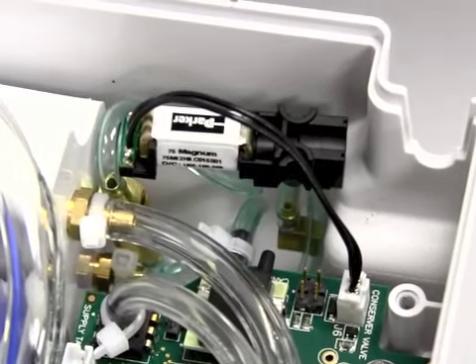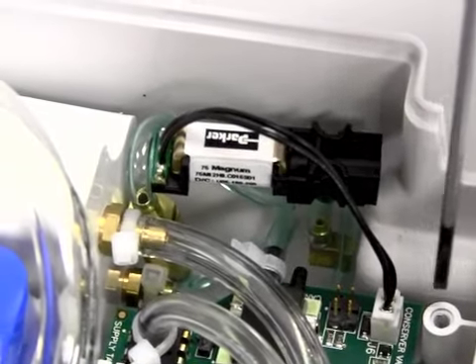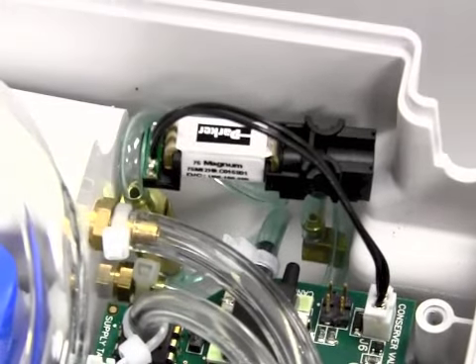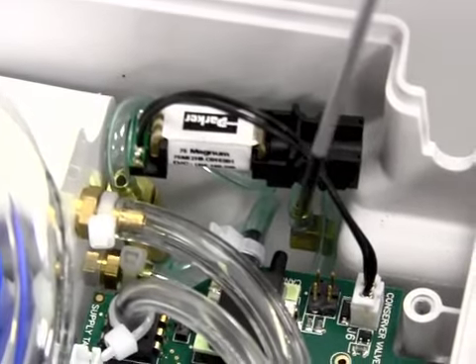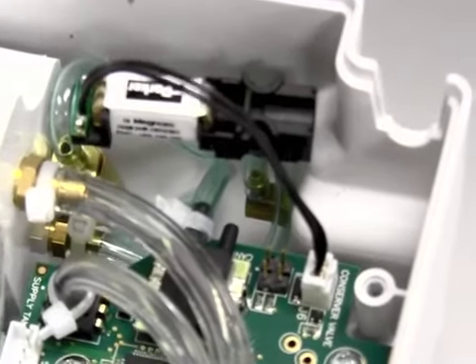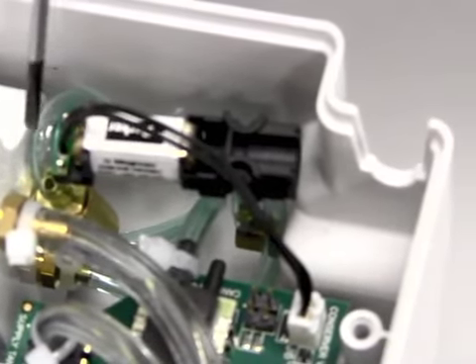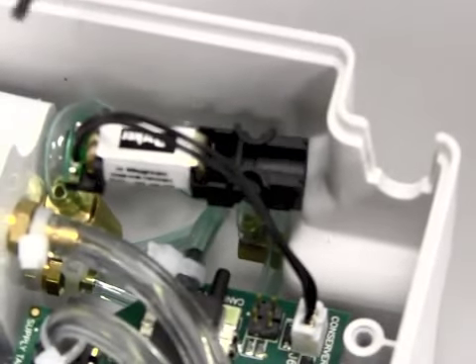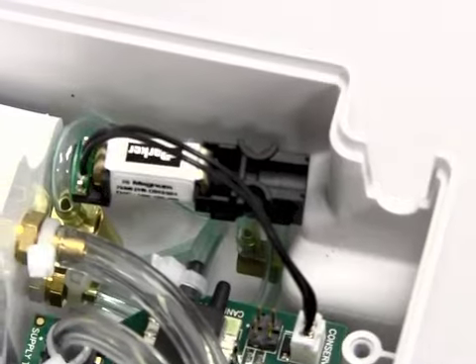This shows that I've reconnected the three-way valve onto the PC board, and the tubing has now been routed from the valve into the pressure sensor. Please note that it's very, very critical that when you're installing this tubing, you make sure that it is not pinched from either end of the isolation valve or from the three-way valve into the isolation valve.